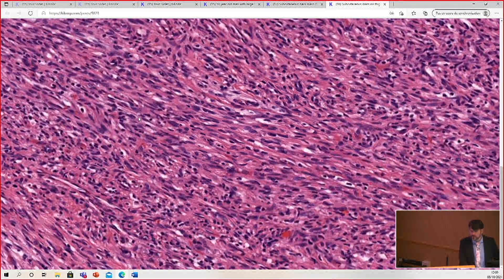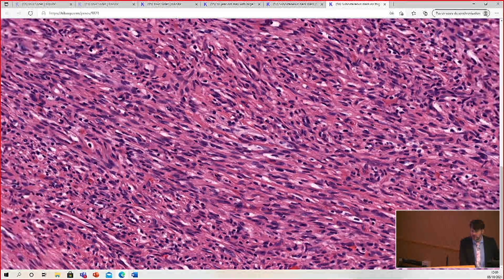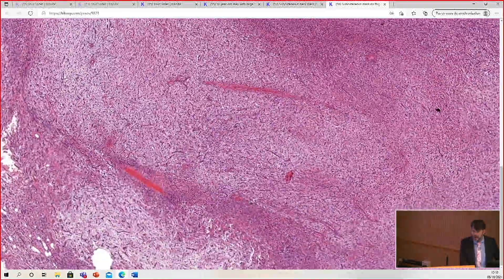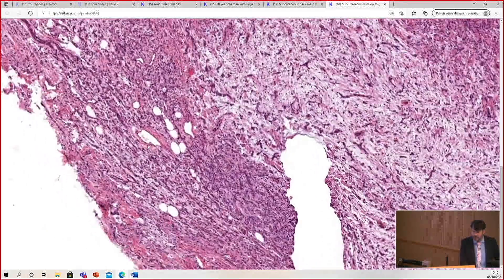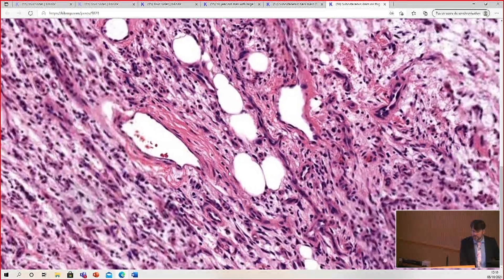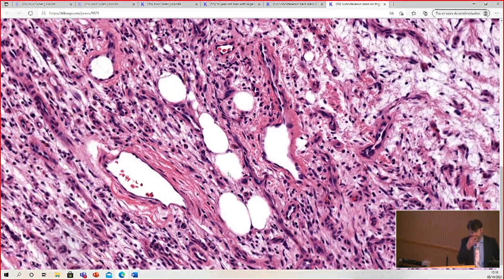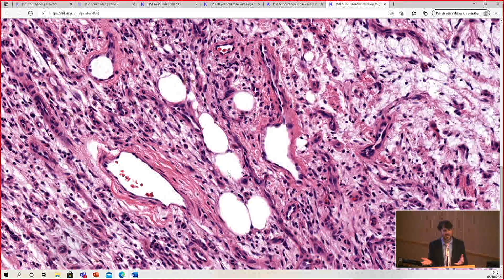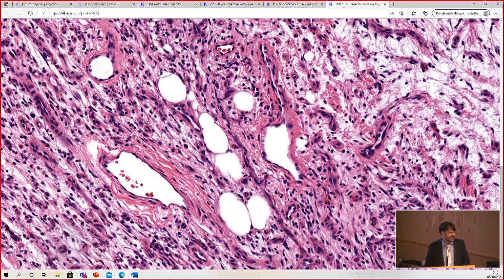At closer look, some areas can be a little more cellular and fascicular, but still very bland. Sometimes you will get some entrapment of adipocytes within this tumor. The pitfall here is that cytologically this looks like a benign tumor, but you might look at it and say this looks like it should be something — but I don't know what it is. It has a very distinct appearance.